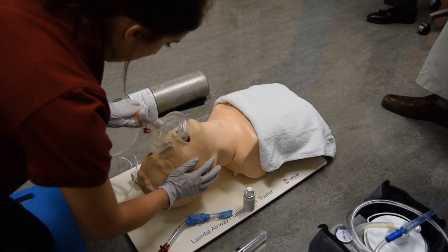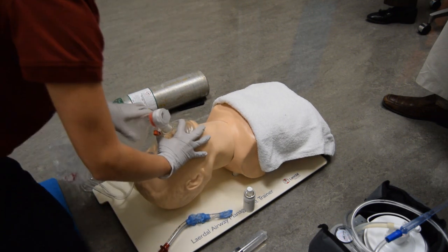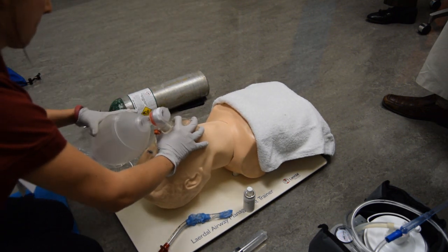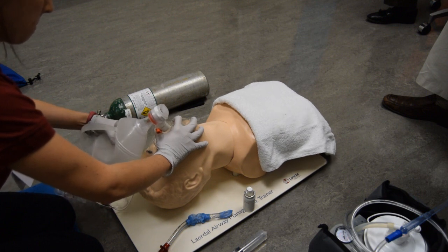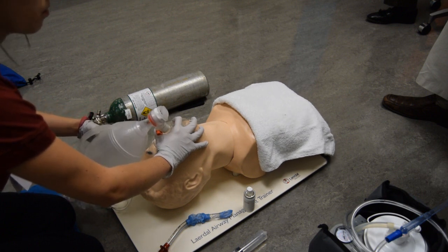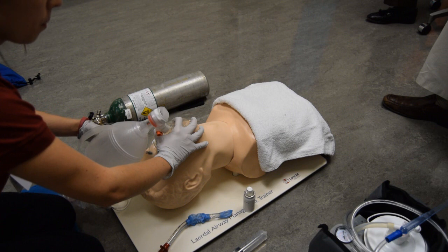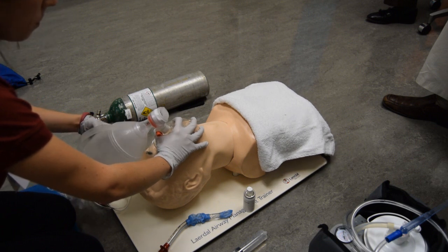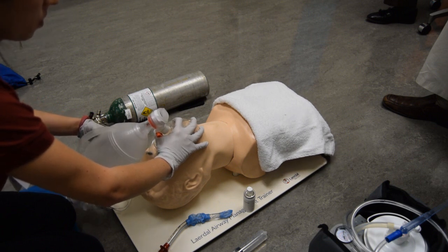Ventilates patient immediately with bag valve mask unattached to oxygen. Ventilates patient with room air.